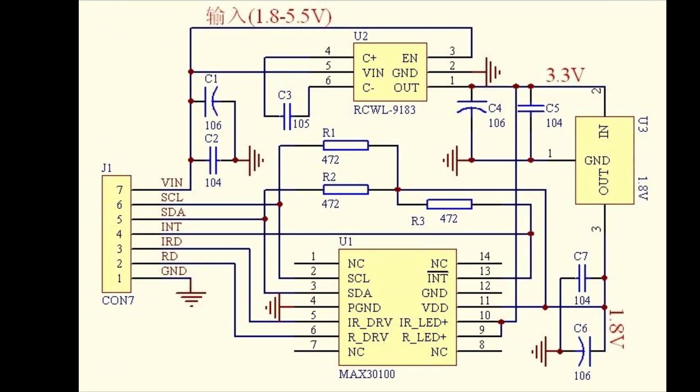This is the schematic diagram of the pulse oximeter sensor. As you can see here, there are two voltage regulators. The first gives a constant output of 3.3V where the input can be anything from 1.8V to 5.5V. The second regulator gives a constant 1.8V output when the input is 3.3V. This regulator is used to power up the MAX30100 sensing module, which requires only 1.8V. Up to here, everything is perfect.